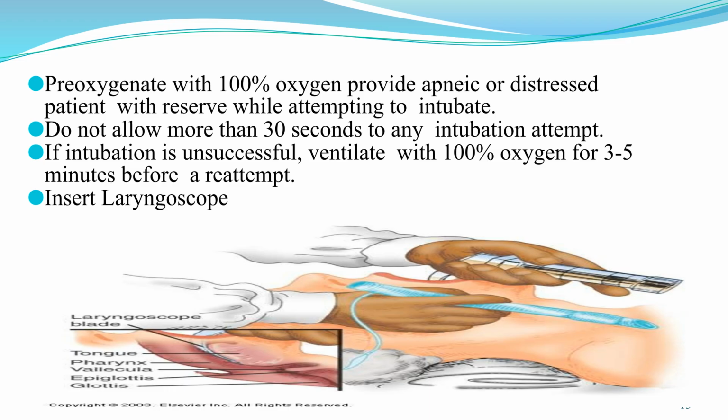The next step in the procedure is to position the patient into the sniffing position to facilitate intubation. Pre-oxygenate the patient with 100% oxygen. Intubation attempts should not exceed 30 seconds. If unsuccessful, ventilate with 100% oxygen for 3 to 5 minutes before reattempting.